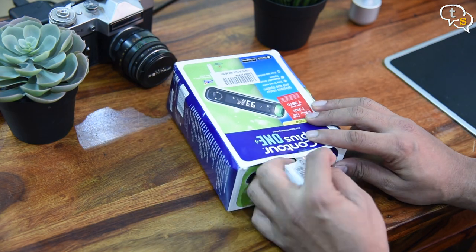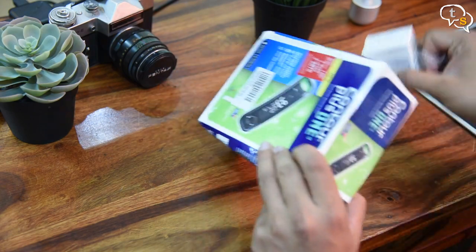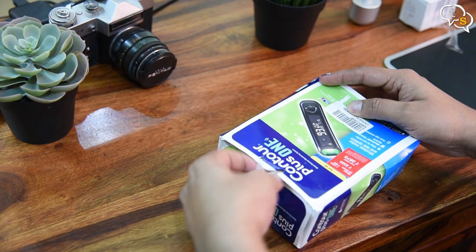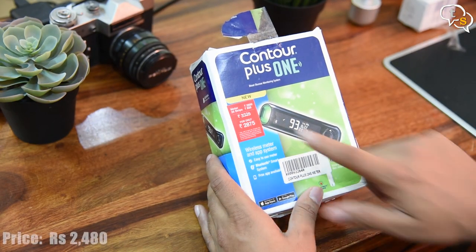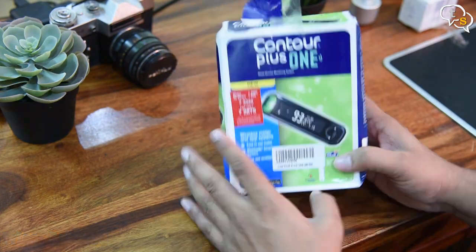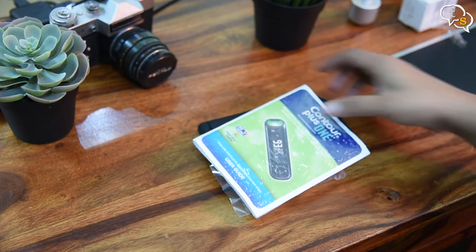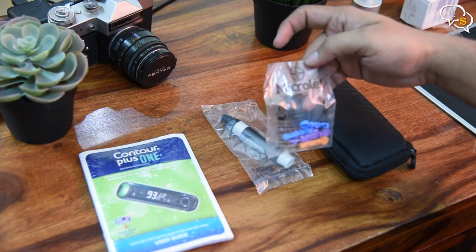So this is what's in the box. We have the glucometer itself and a small box containing 25 test strips. The price on the box is Rs. 2875 but I purchased it off Amazon at Rs. 2480. We also get some instruction manuals, a micro lancing device, a case, and micro lancets called microlets.